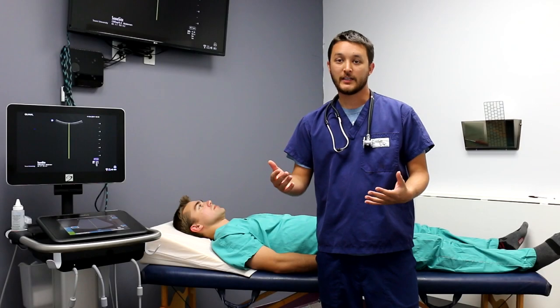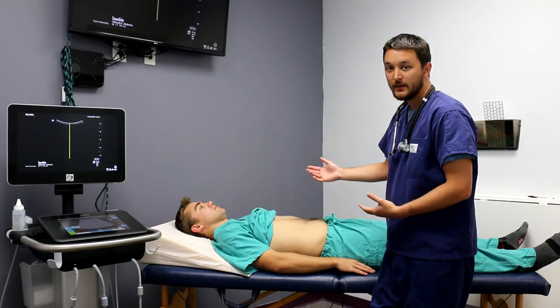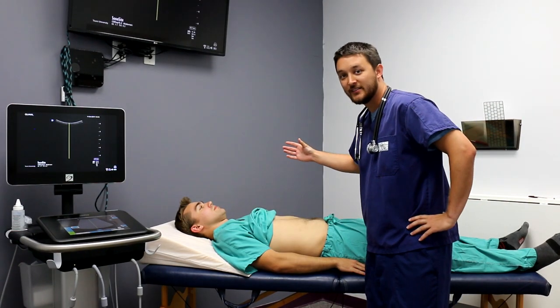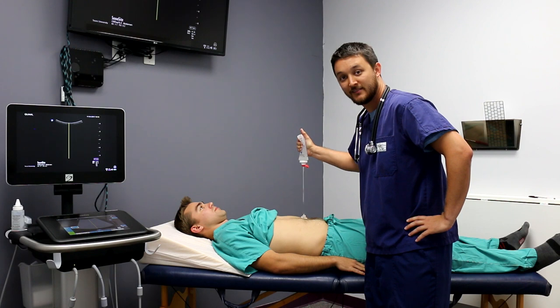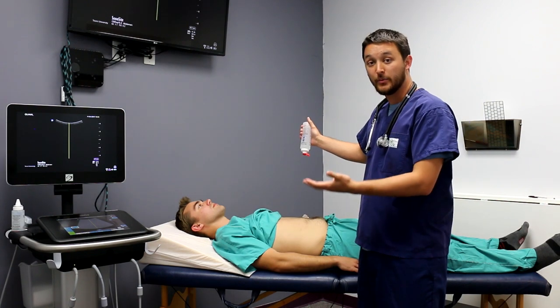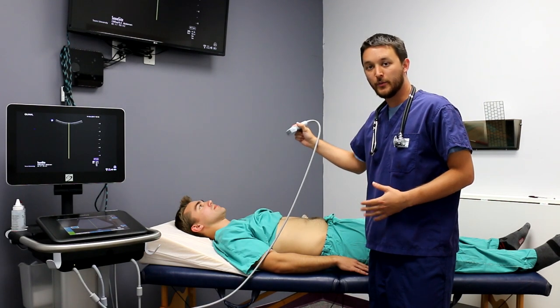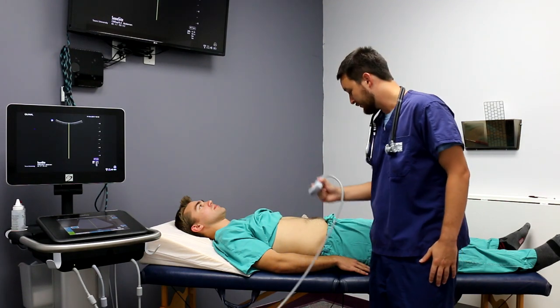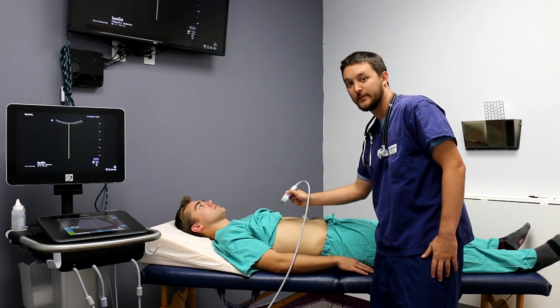We begin the exam by exposing the patient's abdomen. Next, we add plenty of gel. Then we grab our curvilinear probe. Be sure to hold the probe like a number two pencil for stability and control.